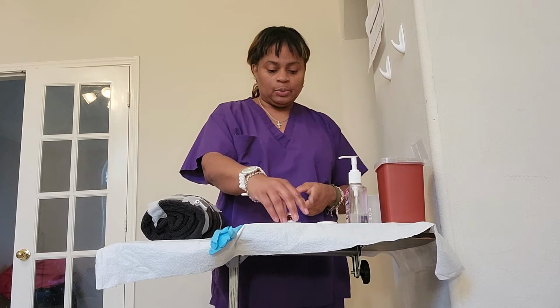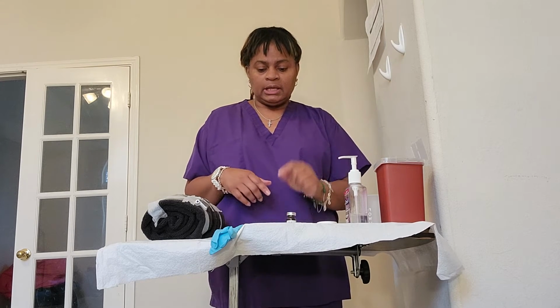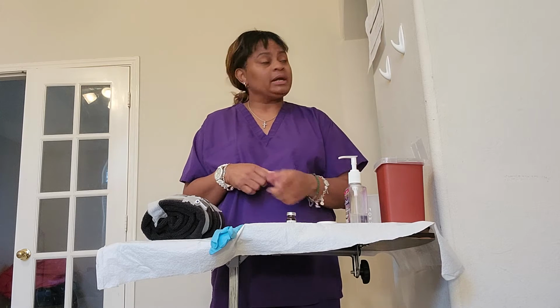So I'm going to verify once more because I'm going to draw the medication up, and that's again Millie Larson. Date of birth is 1/1/36. MRN 123456. No known allergies. We're giving her furosemide, the 20 milligram IV push. It's going to be every 12 hours, so we're going to do it over 2 minutes. The medication is due now, and we're going to be following it with 3 mLs of normal saline, before and after. It's for edema and blood pressure.